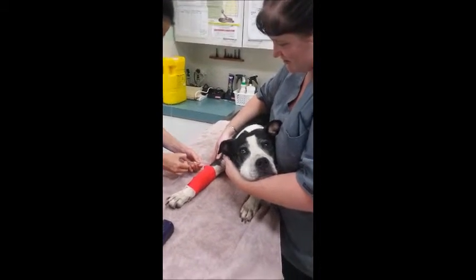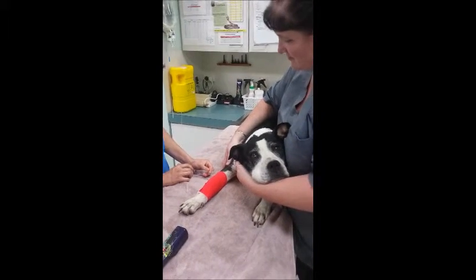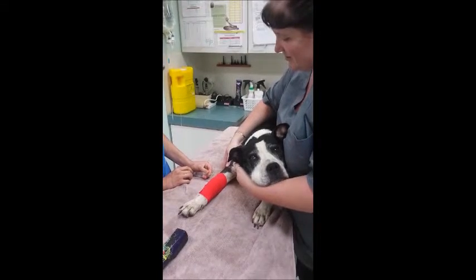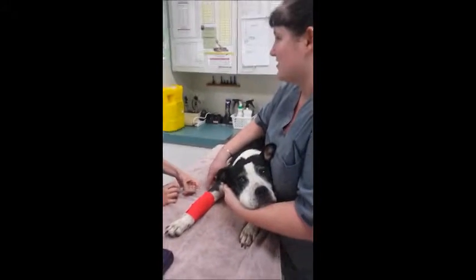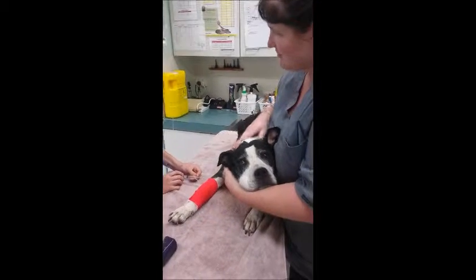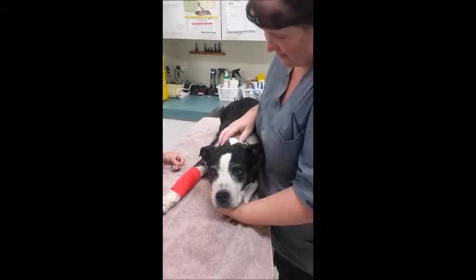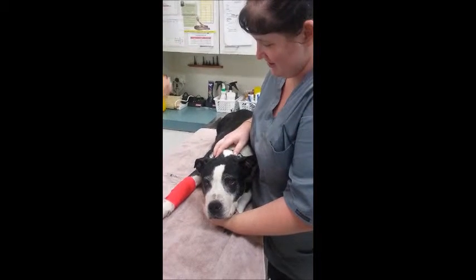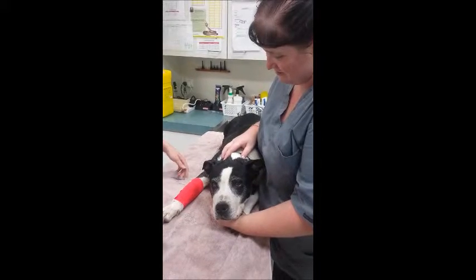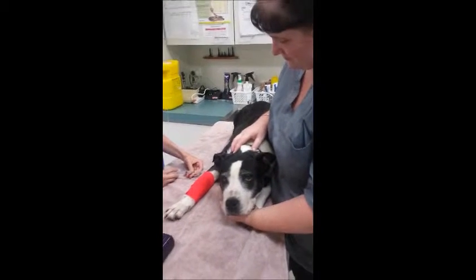The induction agent, which is alfaxan, is administered intravenously. As the veterinarian is administering the induction, I provide feedback regarding the patient's consciousness. The patient becomes more relaxed and the presence of the palpebral reflex becomes sluggish as the induction starts to work. The veterinarian then opens the fluid control on the intravenous fluids to flush the catheter after administering the induction.